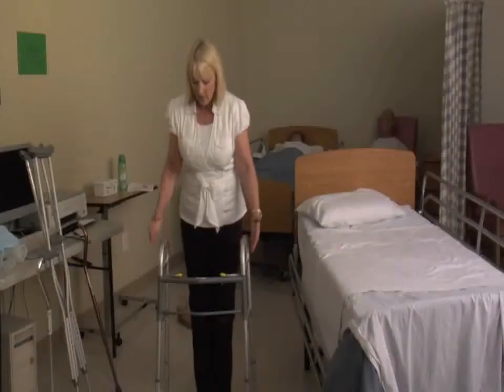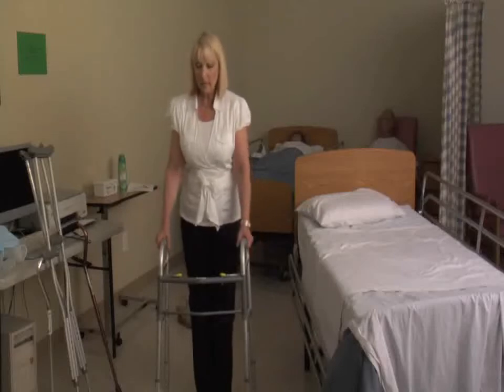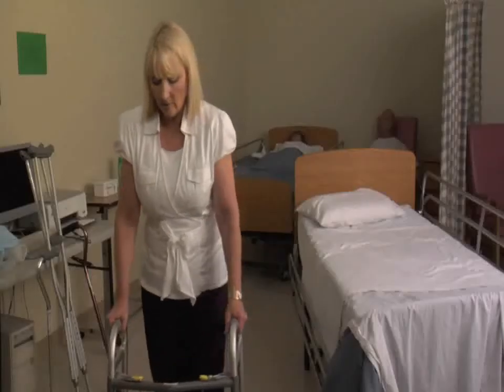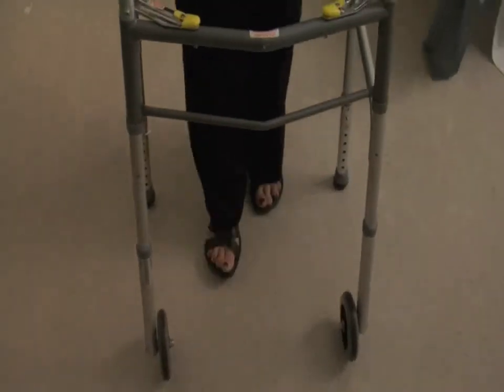So if the patient has a walker that has the legs, they'll pick the walker up and make sure the walker's firm, and then they'll move the weak leg forward first, if they have a weak leg. If not, they can just walk naturally. If they have a walker with wheels, they can just move along with the wheels. There we go.